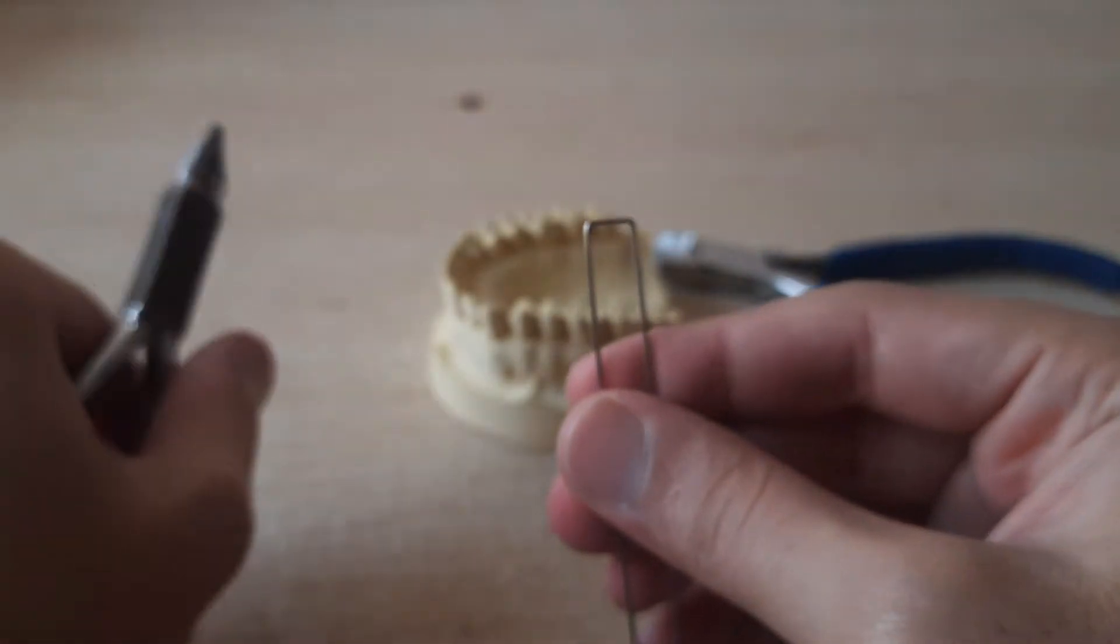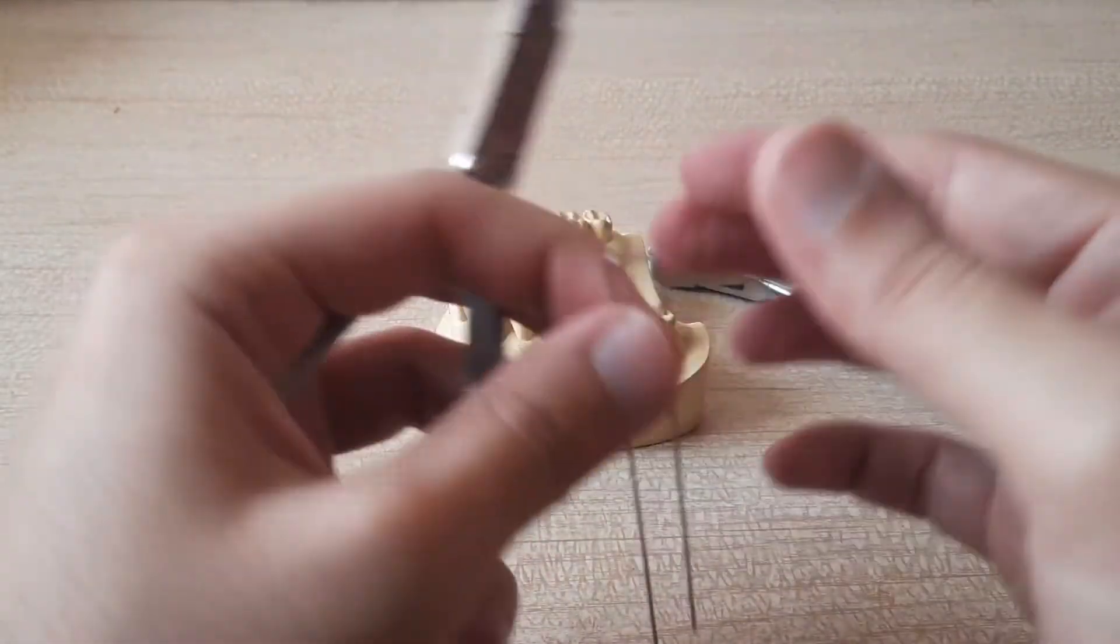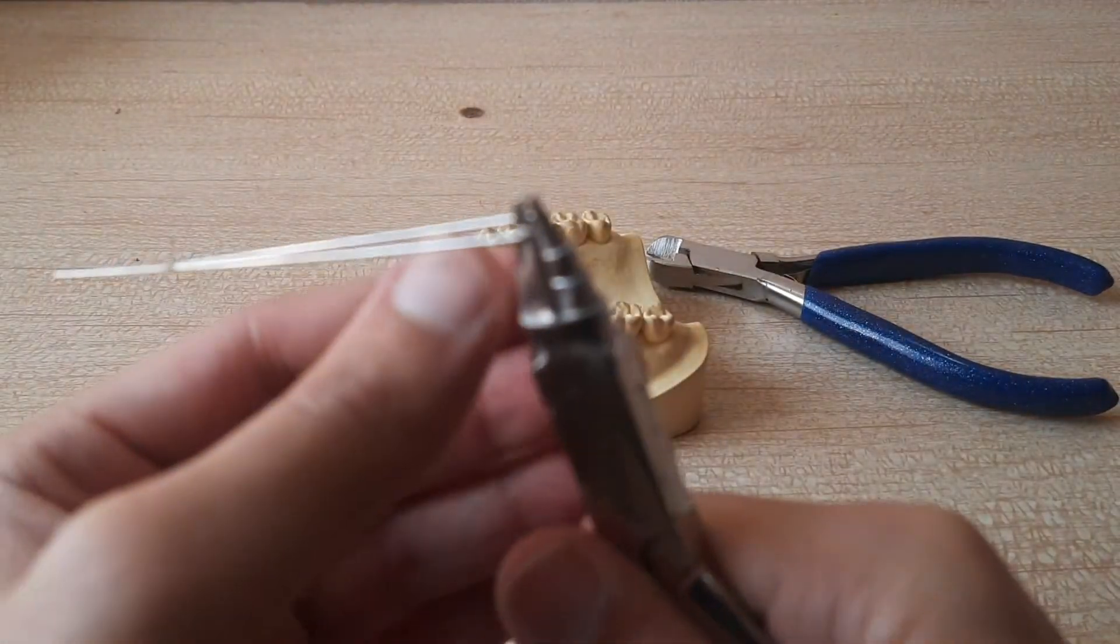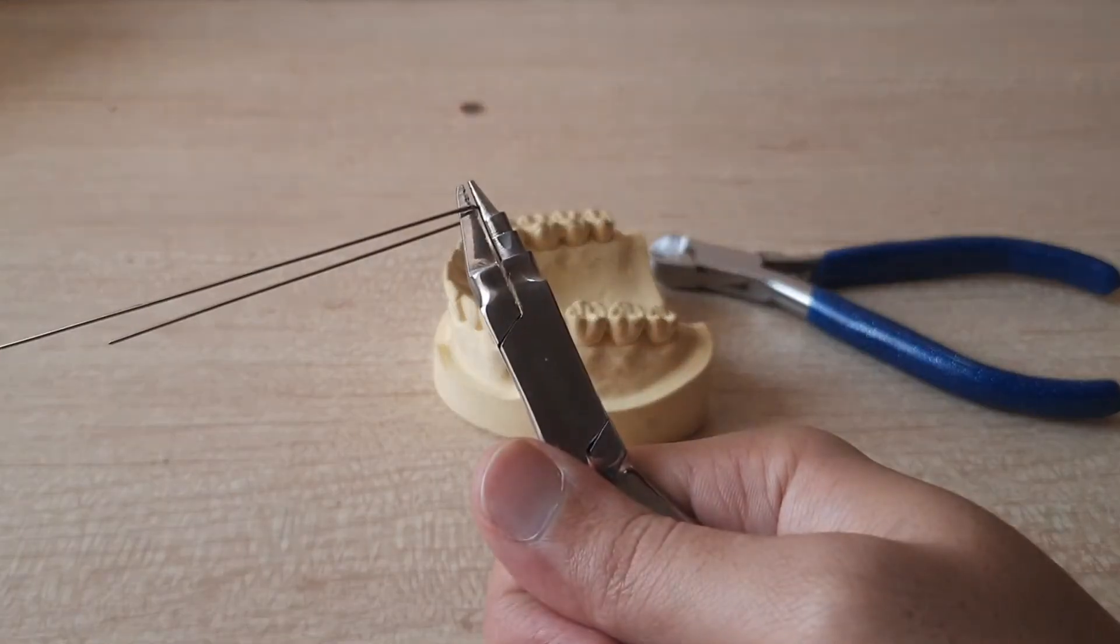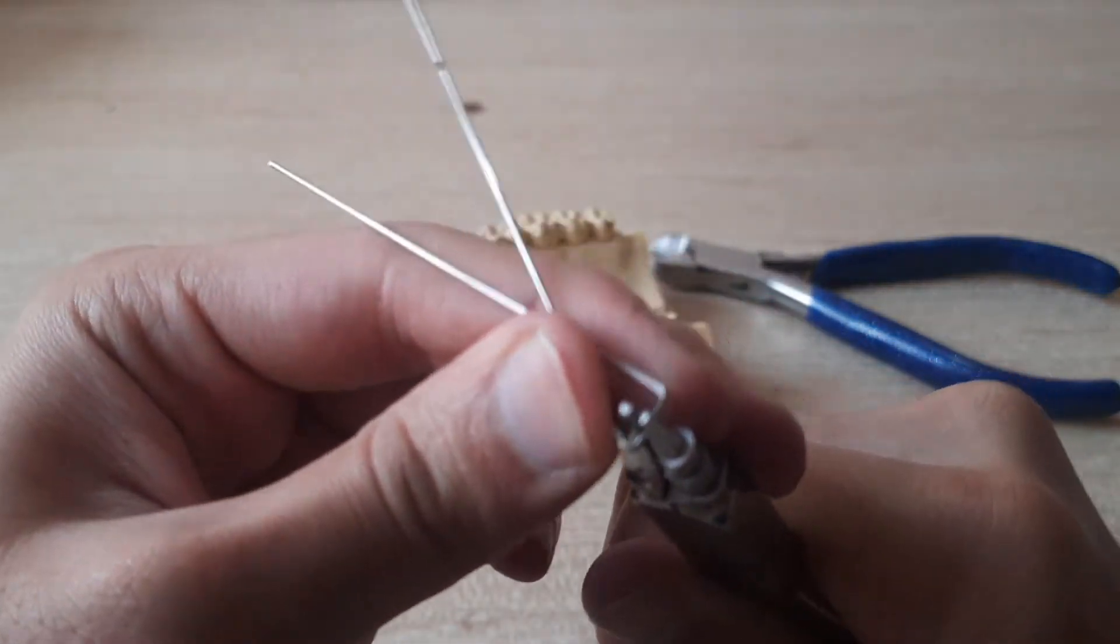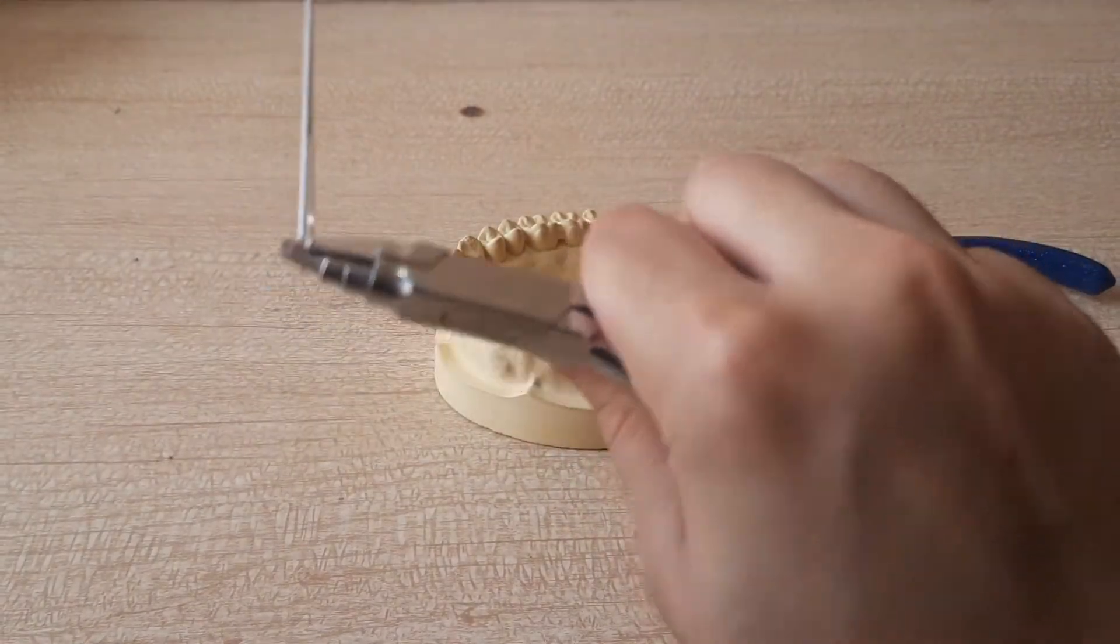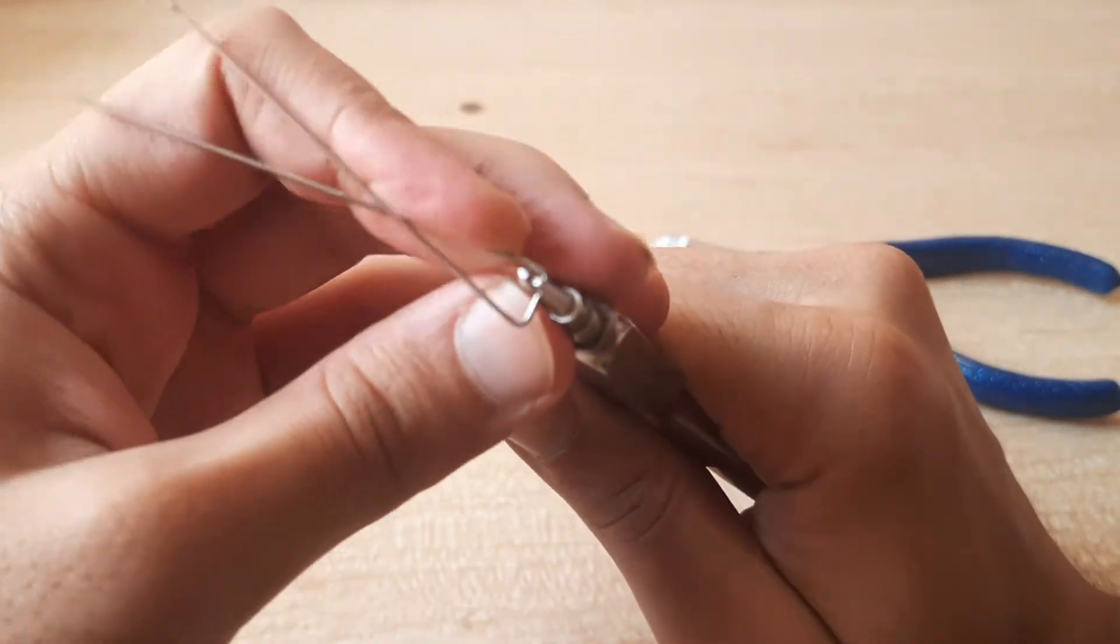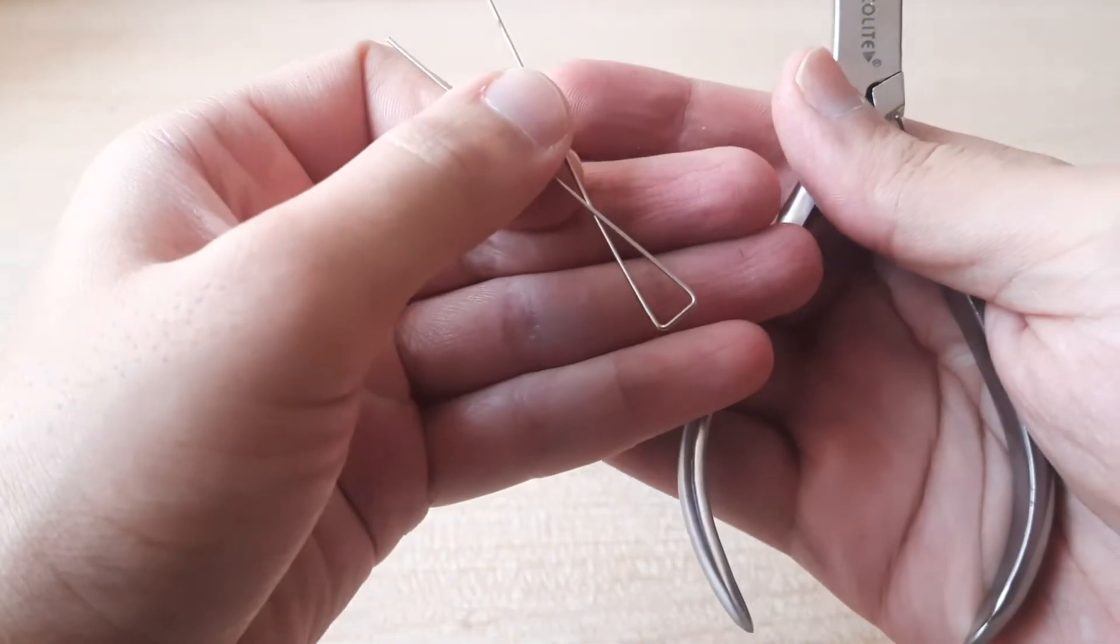Now you leave around one to two millimeters of space from that part and again just around two millimeters and just again bend it. So we have something like this with us, two right angles we have but I actually bend it a little more so that it properly engages into the undercuts.